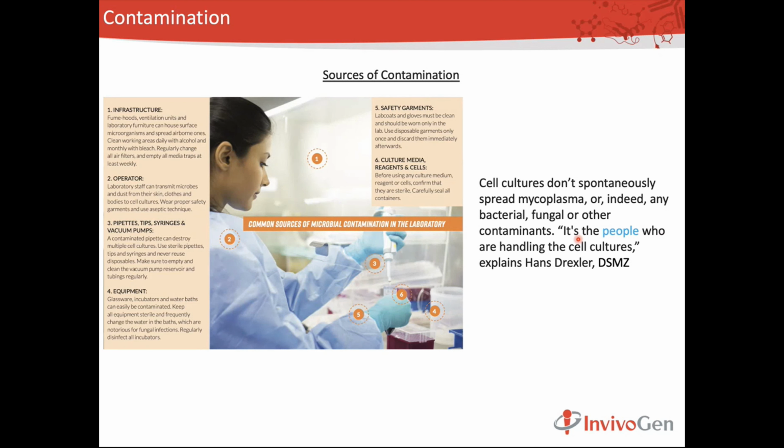In your mouth there are lots of mycoplasma and maybe some bacteria, and those aerosols, when you talk, can easily spread to the cell culture. People are one of the major factors, because the others we can control. Tips, cell culture media, these hardware items we can control and clean, but people are the main source. So take-home message: protect yourself when doing cell culture, and don't talk.